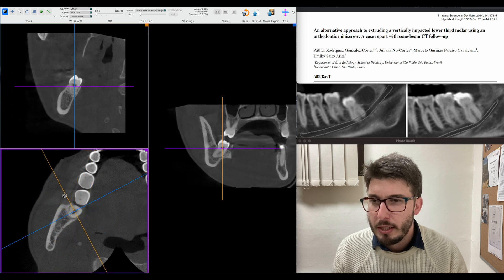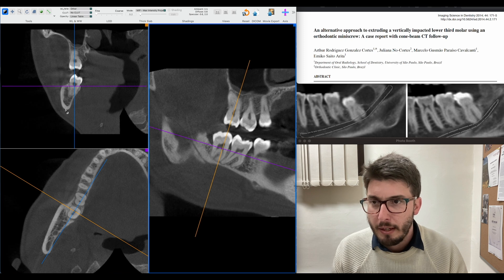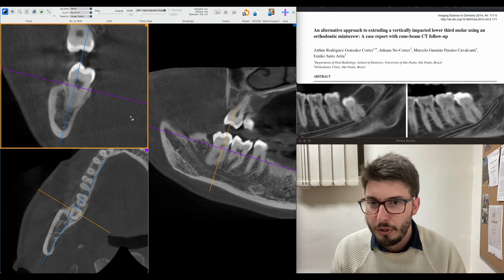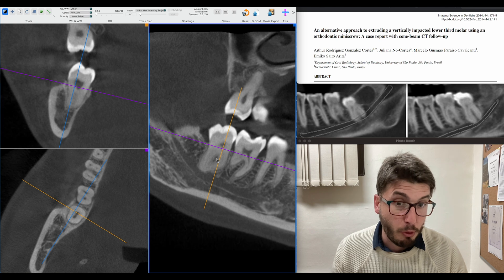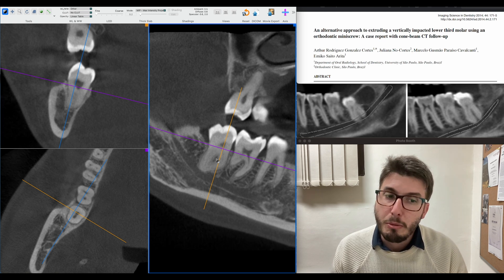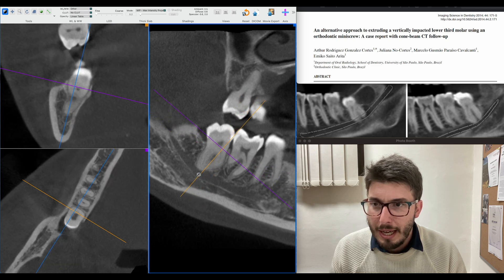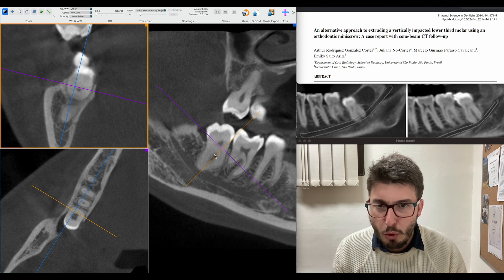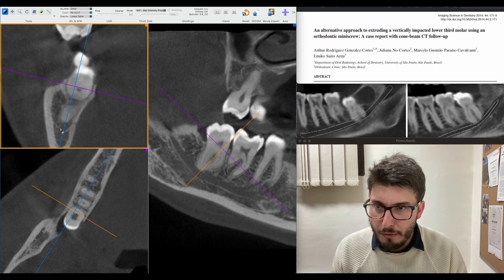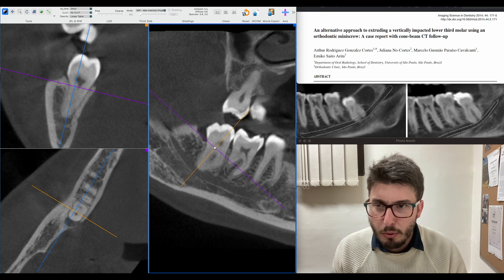Adjusting the axis to the correct orientation, I change it to produce a nice cross-sectional image — now visible in the top left corner as a tilted coronal plane. We can see the mandibular canal very close to the roots. The roots appear fused but there is still a bone septum in between them. Looking at the mesial root, the apex is close to but not trespassing the upper cortical of the canal. Moving to the distal root, the cortical is still visible.